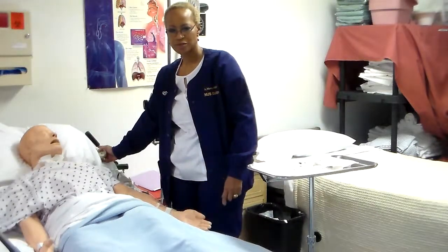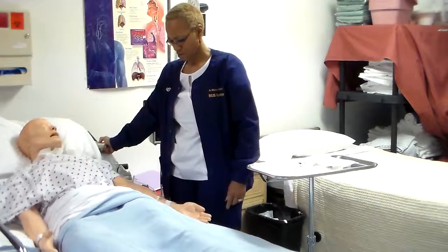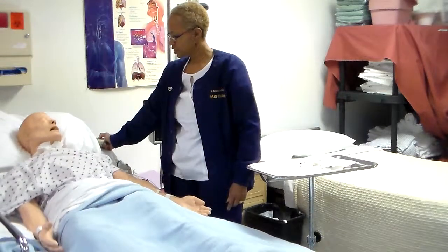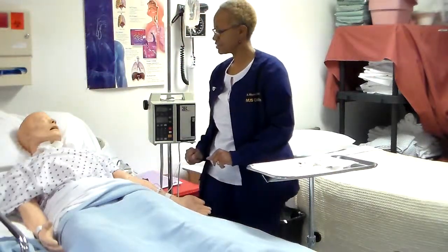I'm going to push that tape off. All right. Here we go. Just raising your bed so I don't have to bend my back so far. Great. Okay, your site looks wonderful. Does it have any burning? Everything's okay? Great. No problems at all with your IV site.